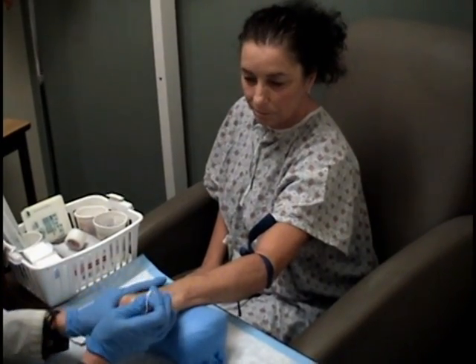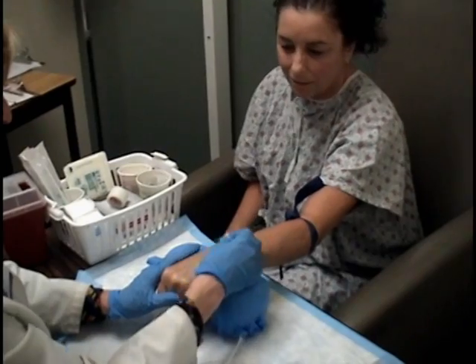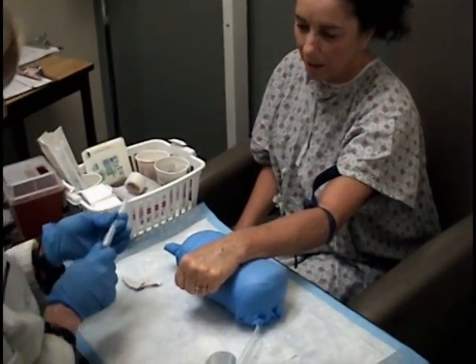After the first isotope is injected through the IV it will be necessary to wait 15 to 20 minutes before the resting images can begin.